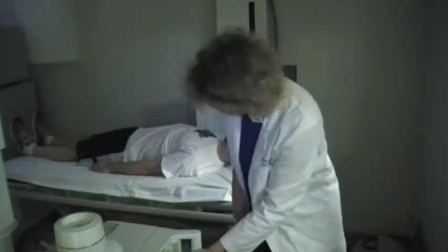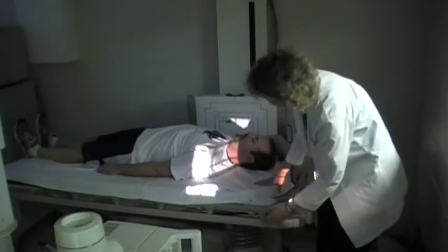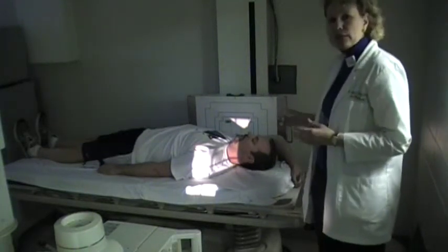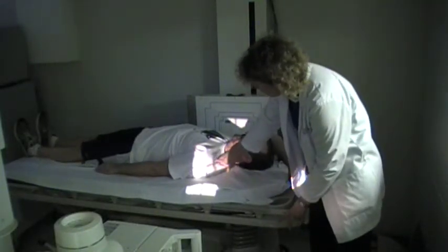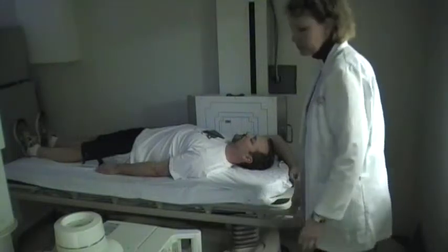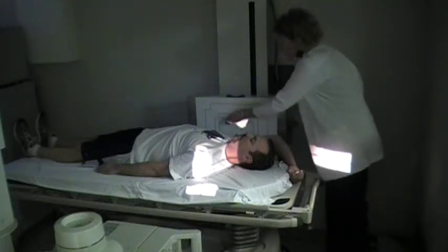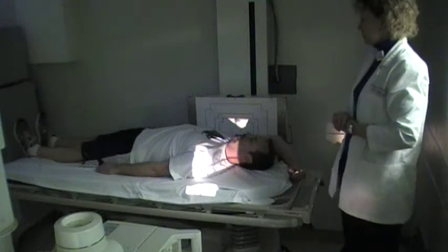Once we get the patient's arm positioned for the swimmer's, we're going to come down with our central ray, cutting across at the very top of T1. If I'm unable to palpate the vertebral prominence, usually if you just aim directly right above the shoulder, that's usually a good area for the vertebral prominence. The patient's right side is still up against the image receptor, so keep the right marker there.